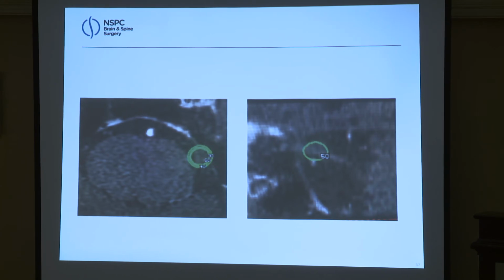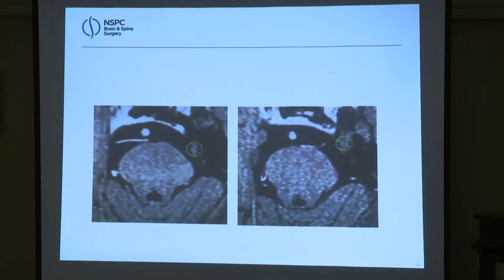And this is, again, a super magnified view. We can see the nerve beautifully. This is another lady who had multiple sclerosis, and about 2% of people with MS have trigeminal neuralgia. You're not going to do an MVD for them because the presumptive cause is not an artery. And we did a treatment for her.